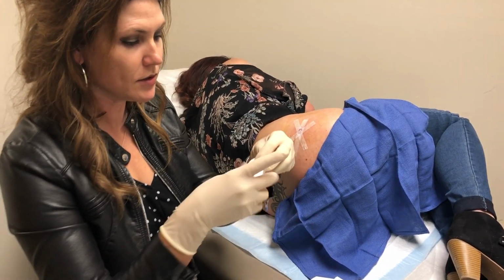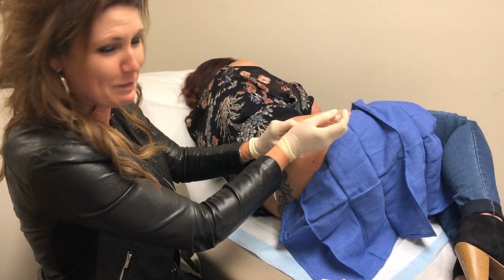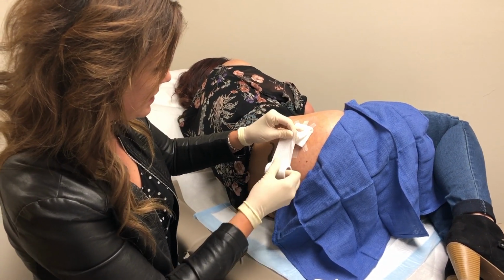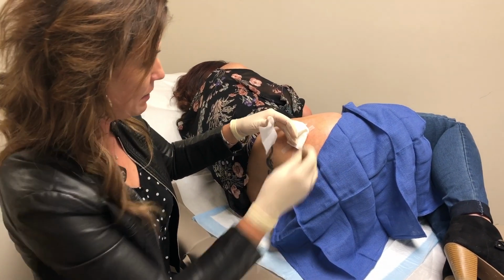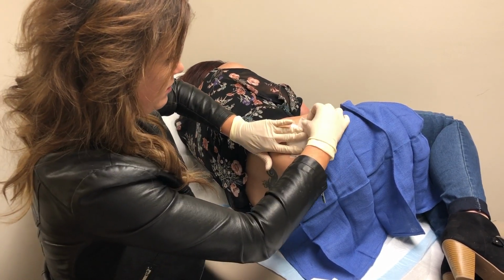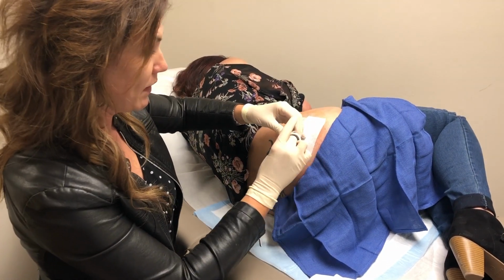And then my nurse, who is filming, typically cuts some tape for me, but can't. But we'll just dress this with some really sticky tape that stays on for at least the next 24 hours. We tell patients no showering today, but that they can shower tomorrow. But again, those steri strips stay on for 3 to 5 days.